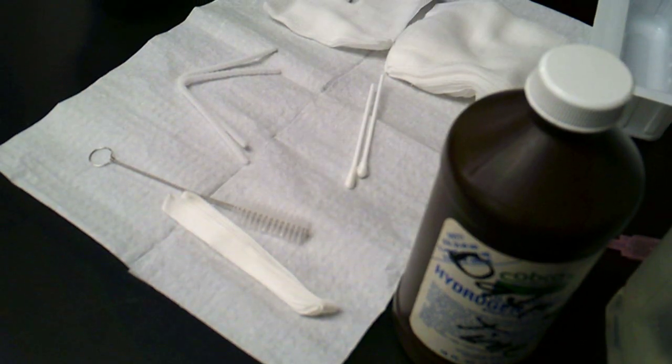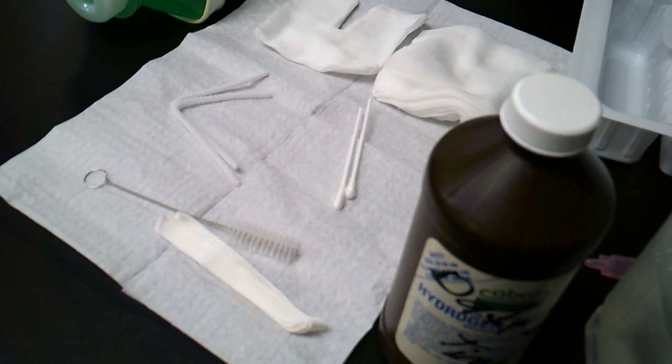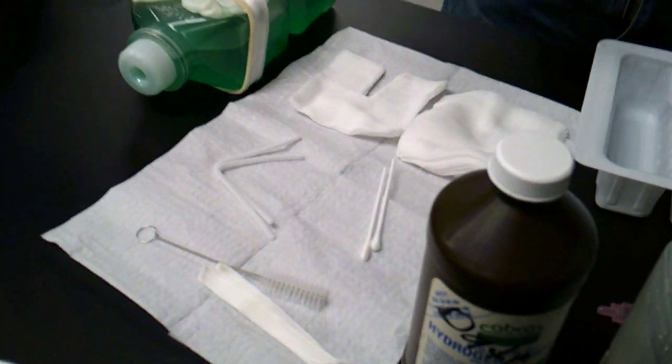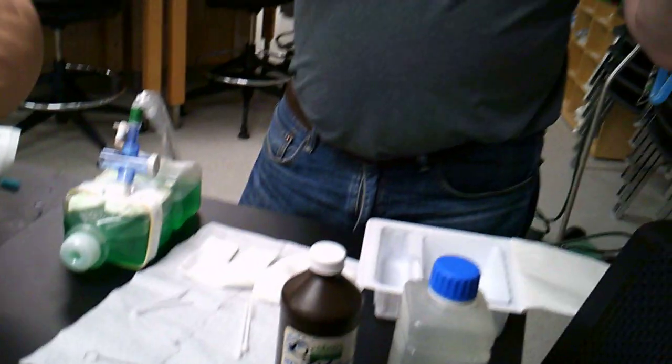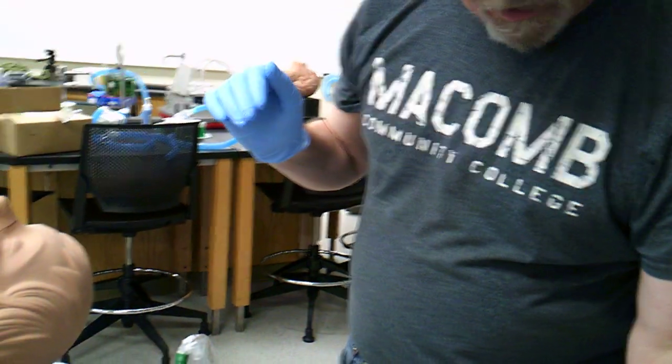And we have some trach ties also, but we're going to use the disposable ones in the process. So now, sterile, sterile hand, non-sterile hand. I'm going to take my non-sterile hand and open my water.